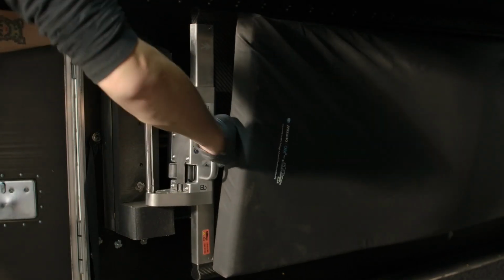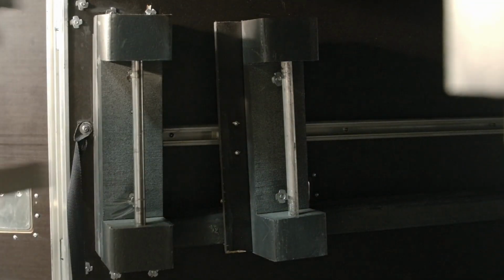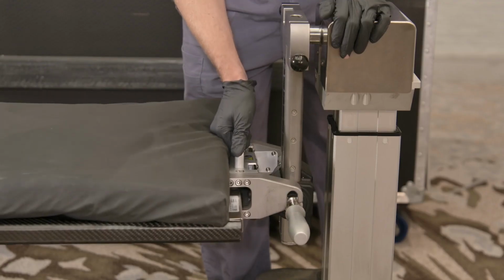Press the two black levers located at the front of the table to release the table from the sliding track on the crate. Press the black levers at the back of the table to fully release the tabletop. Set the tabletop on the tower mounts.